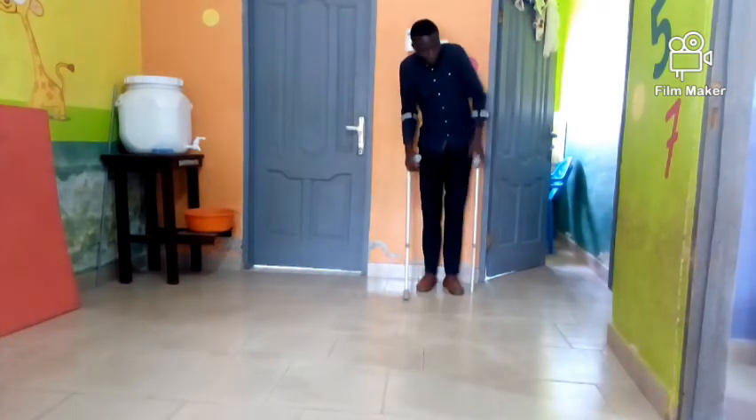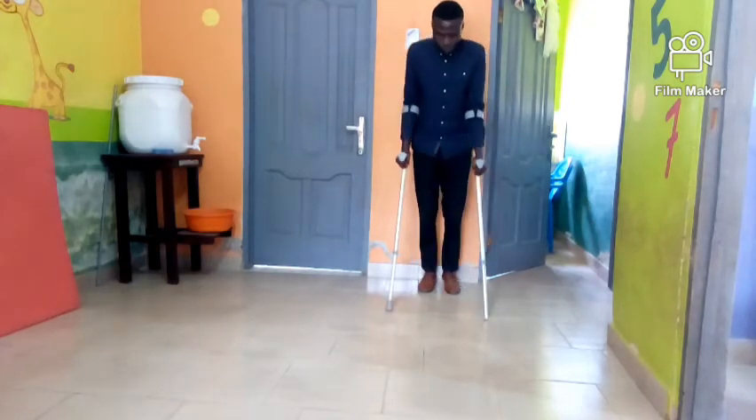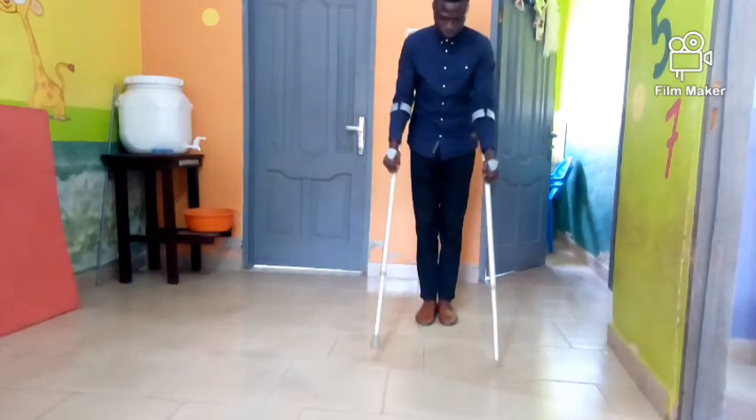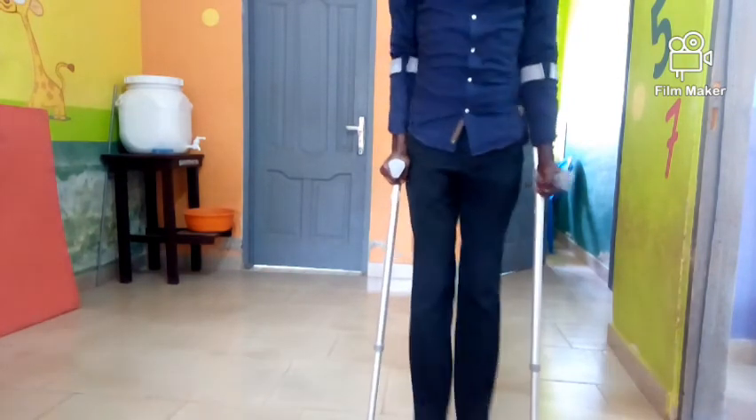Fix the crutches very well, make sure you have a stable stance, then place the crutches forward and swing to. Place them forward and swing to.